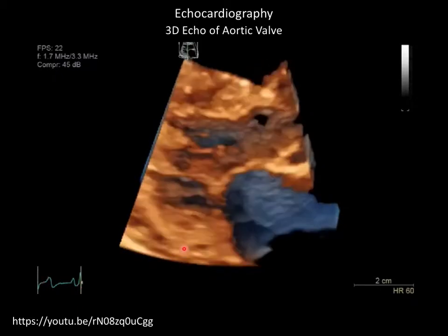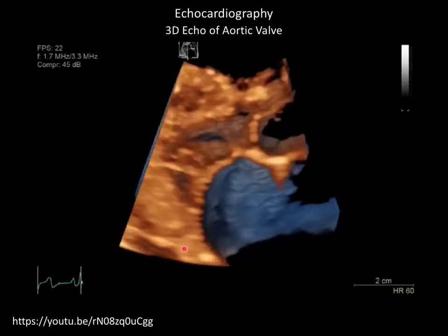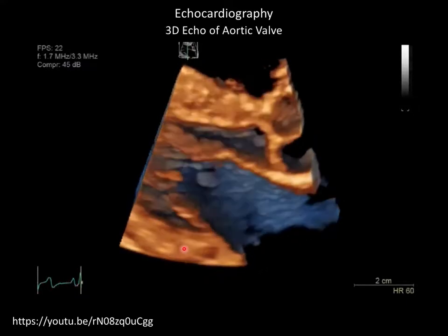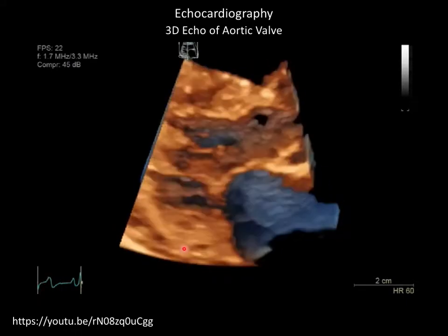For those 3D CTs that we've seen in the slides, are those using contrast, or is that just like a higher dosage so you can actually see the tissue? So the question is, the 3D CT we've seen so far, and you'll see momentarily, there is contrast agent used in order to opacify the blood so that you see the details of the coronary vessels and you see the details of the ventricular chambers.